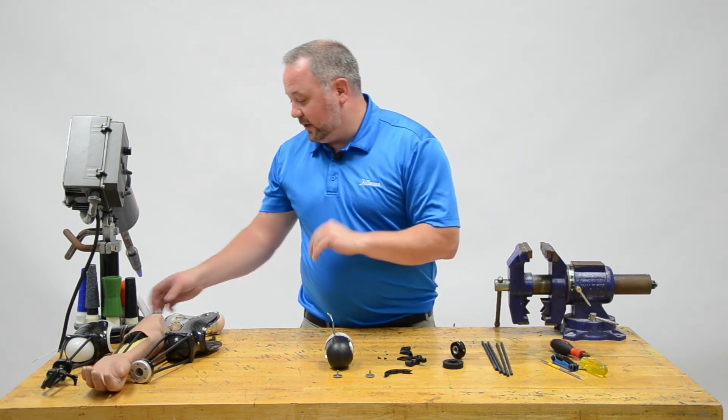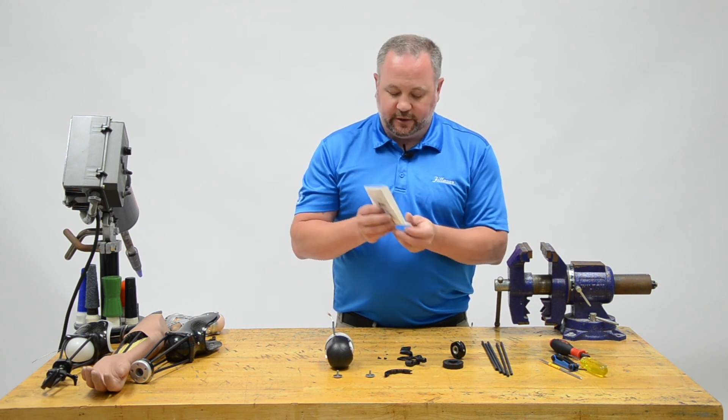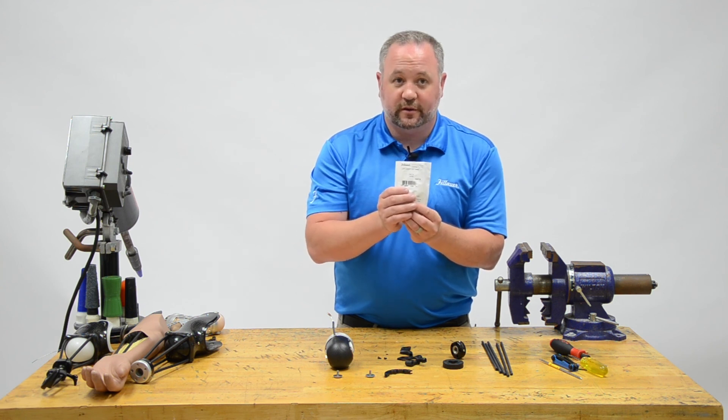Because I put one of these on almost every elbow, I'm also going to install a lift assist on this elbow and show you how to install it as part of this assembly.